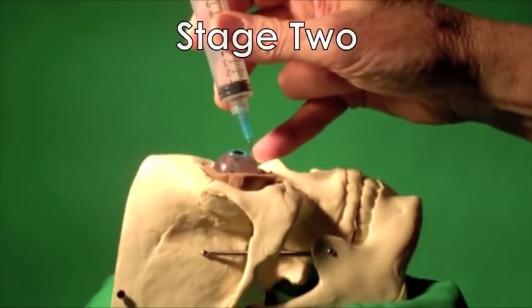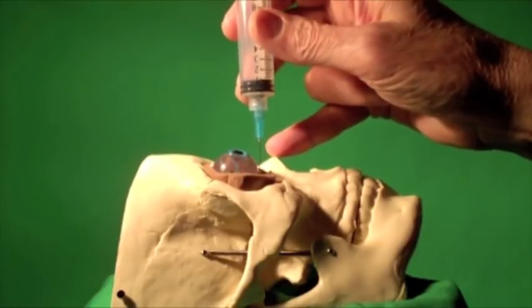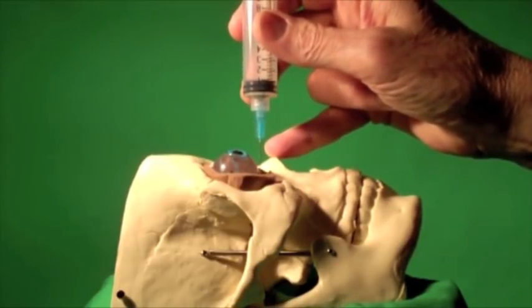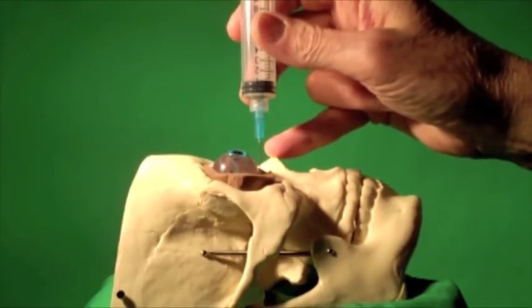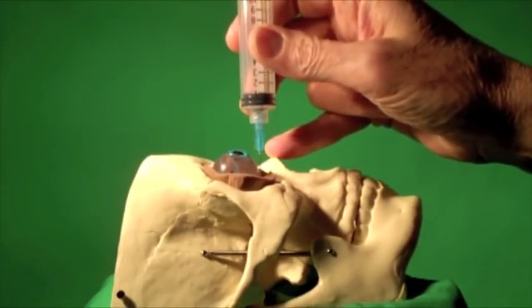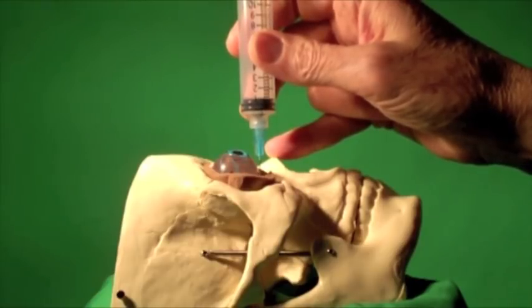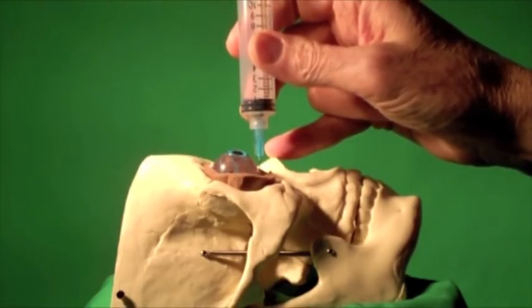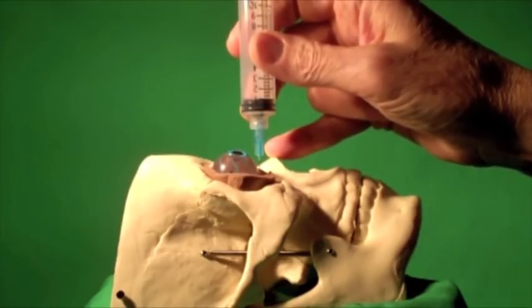Stage 2. The needle tip is then redirected 90 degrees to the frontal plane of the orbit, parallel to the visual axis. Reassess your landmarks and then slowly advance the needle tip posterior approximately 0.5 inches or 12.5 millimeters, passing the equatorial plane of the globe. During this stage, the tip of the needle continues in the extraconal peribulbar space.